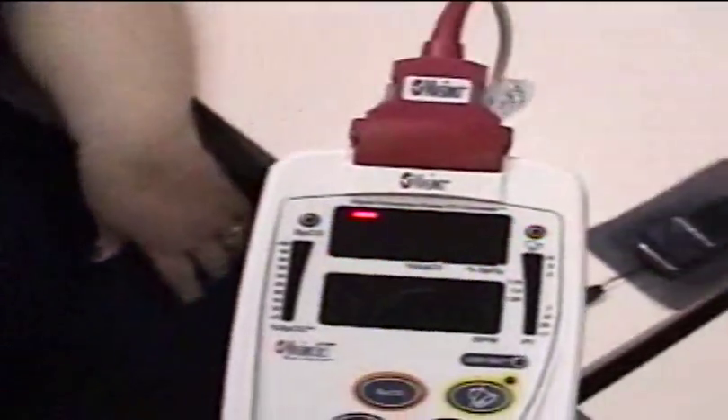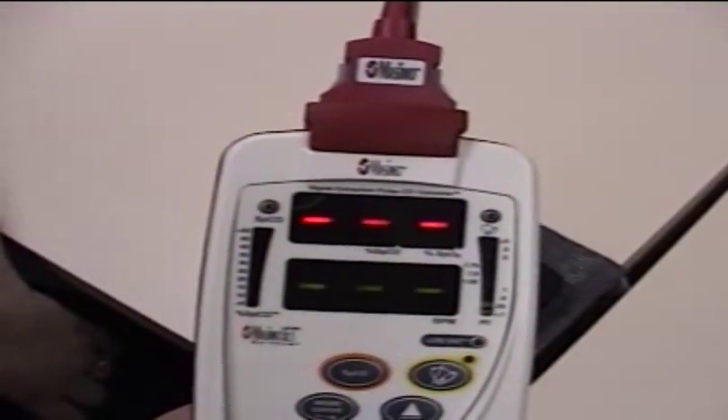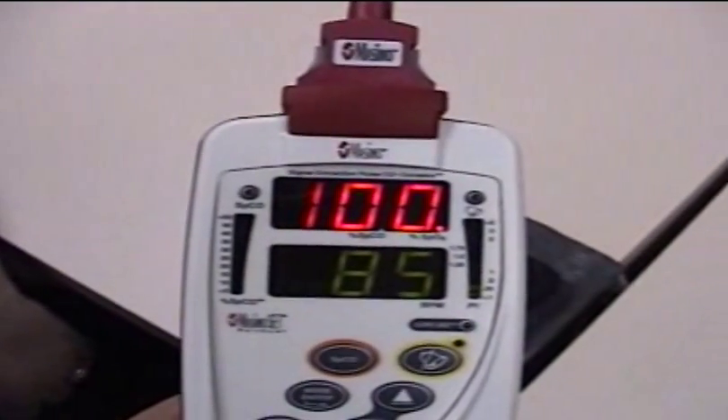This is brown. Readings come in at 99 and 100%.